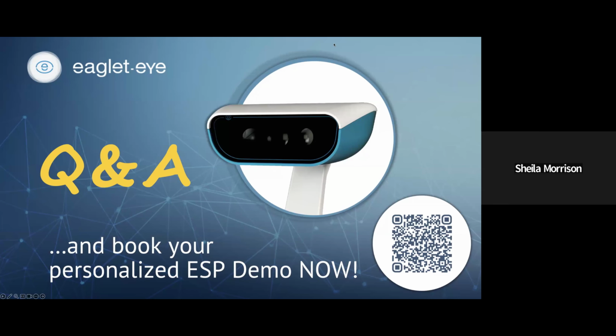Yes, I can start. So probably one of the things that I like to look at is what kind of surface area I'm going to be needing for a particular lens design. Of course, when we're looking at building a lens that extends beyond that central section of the cornea, there are advantages. I use it a lot for determining a modality of scleral, and that with the ESP is something that we can do a little bit more easily.